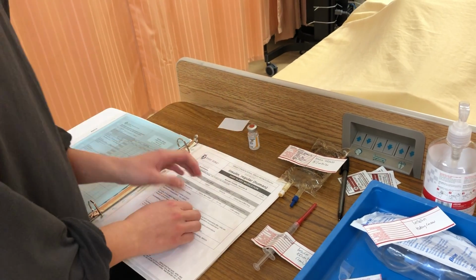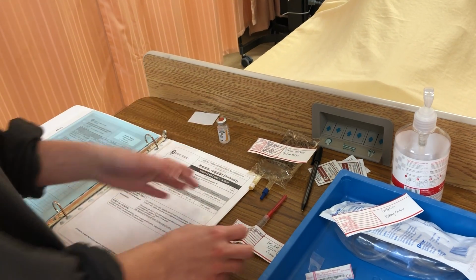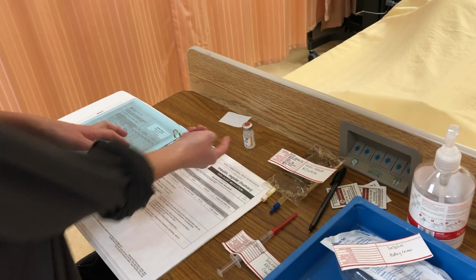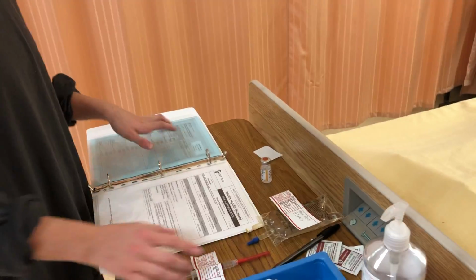I've drawn it up from an IV medication vial. We have an IV bag, and I've drawn it up into the syringe from the IV med. It's been ordered for today and now. We have it as today and now, and we've drawn everything up for today and now.